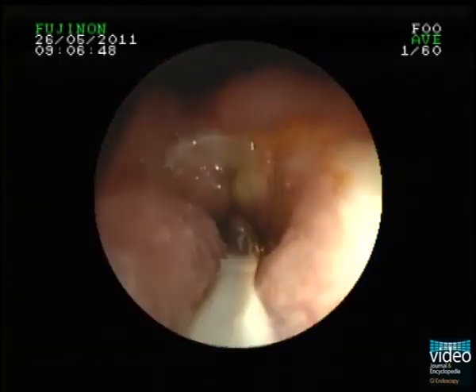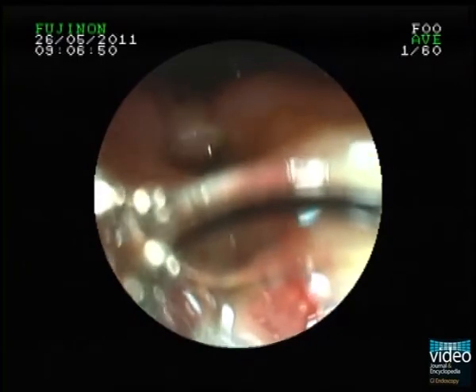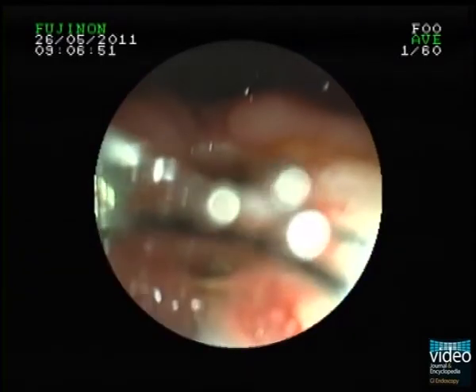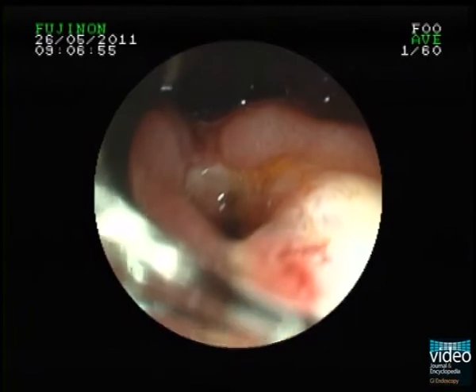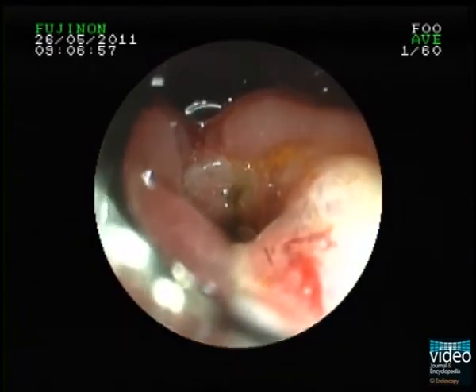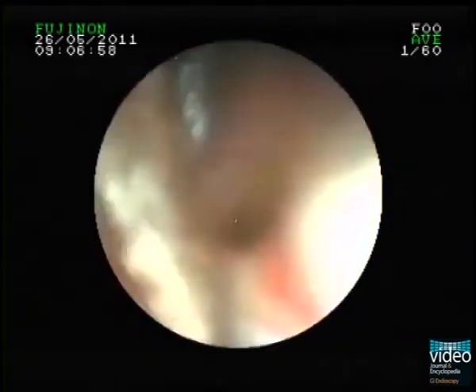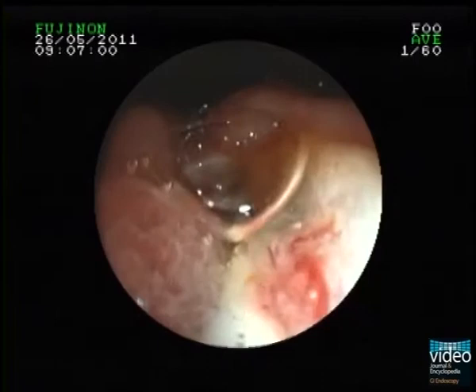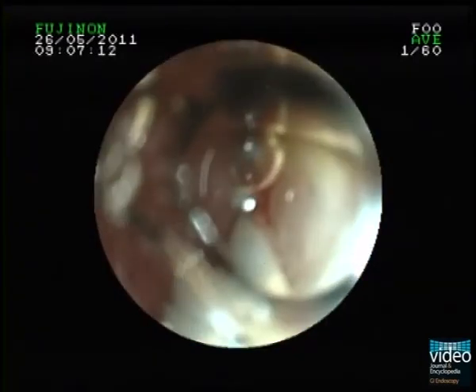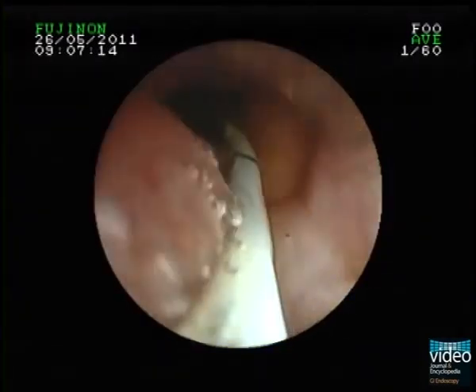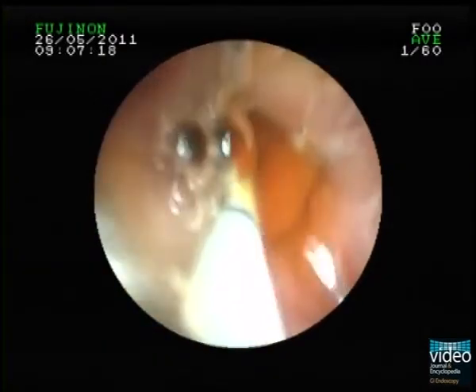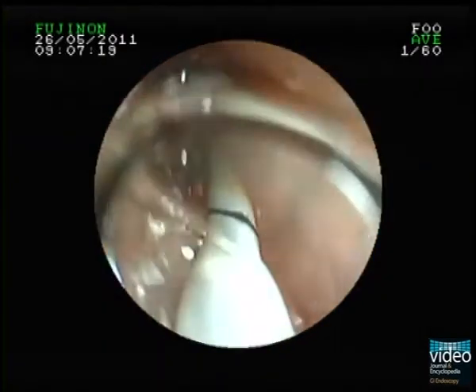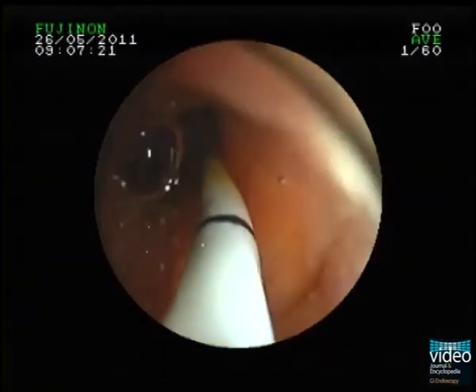Under direct visual and fluoroscopic control, a balloon catheter is advanced freehand into the common bile duct. The balloon is inflated to anchor the catheter inside the duct, and the endoscope is advanced over the catheter into the common bile duct using a ropeway method.